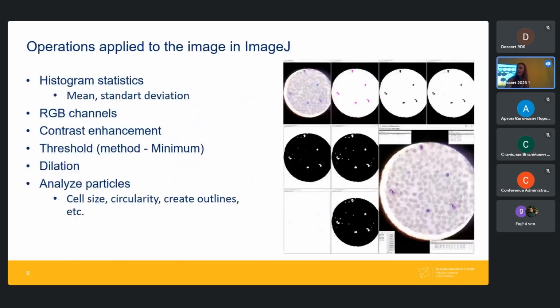Oh, this one? Essentially you have the image and you sequentially apply some of these operations, and you are able to identify the regions on this whole image. So these have been done at a pixel level, I would say, because you can either mark those as squares, or you can also mark the borders.